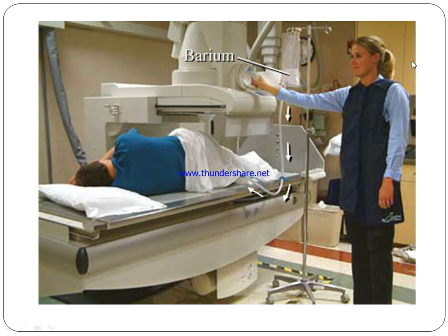The patient is in a lateral recumbent position. This is a barium tube, and it is connected to a syringe through a pipe or tube into the rectum region, and the radiographer takes a radiograph. And this is a pouch of barium.